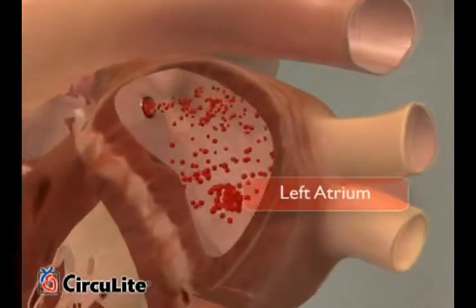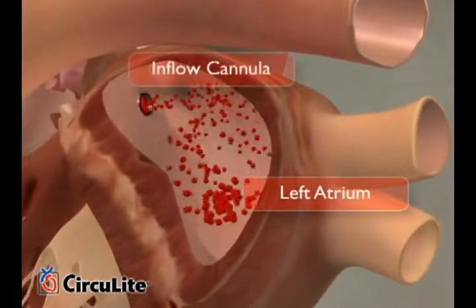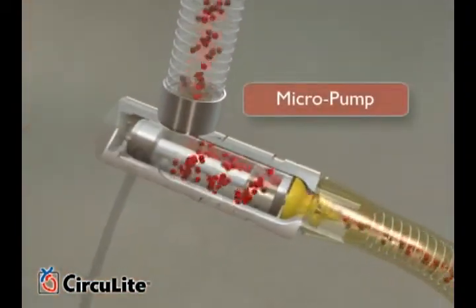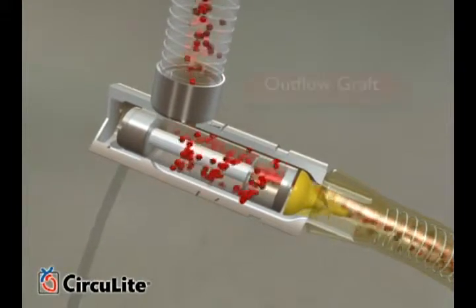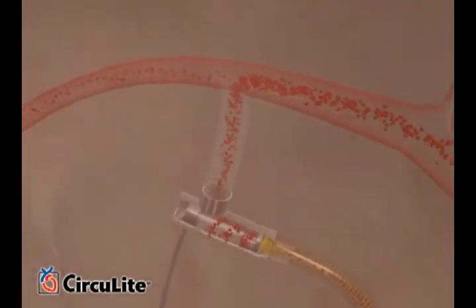When turned on, the micropump draws oxygenated blood from the left atrium through an inflow cannula. Blood moves through the micropump via a proprietary self-washing flow path, then is pumped out into an outflow graft which is attached to the subclavian artery.